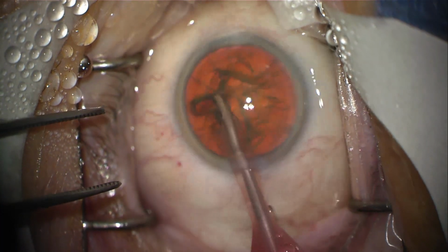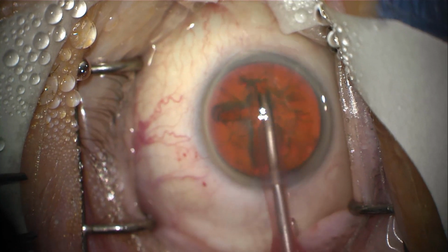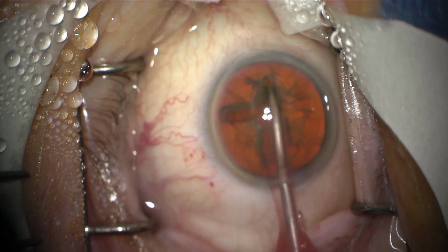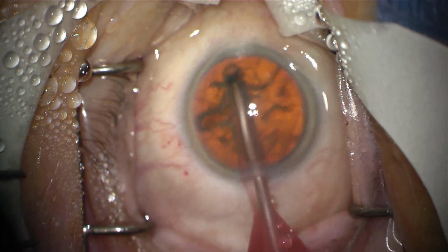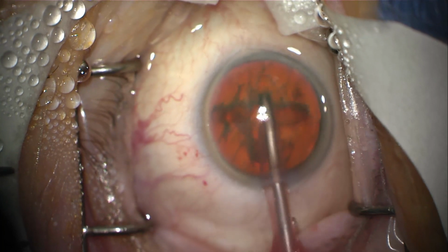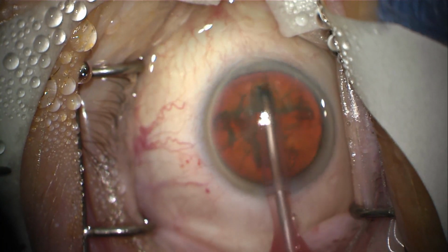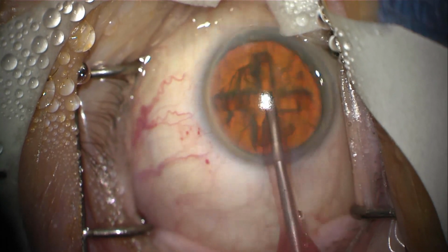I now rotate the cataract another 90 degrees and I make another groove or incision, more sculpting. And when I'm in approximately 90% depth of the cataract, I stop because I don't want to tear the capsule in the back of the cataract. I don't want to break the shell of the M&M.